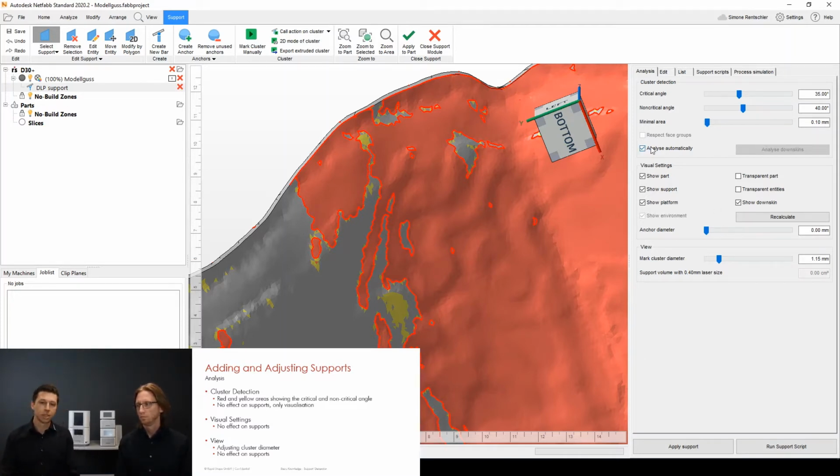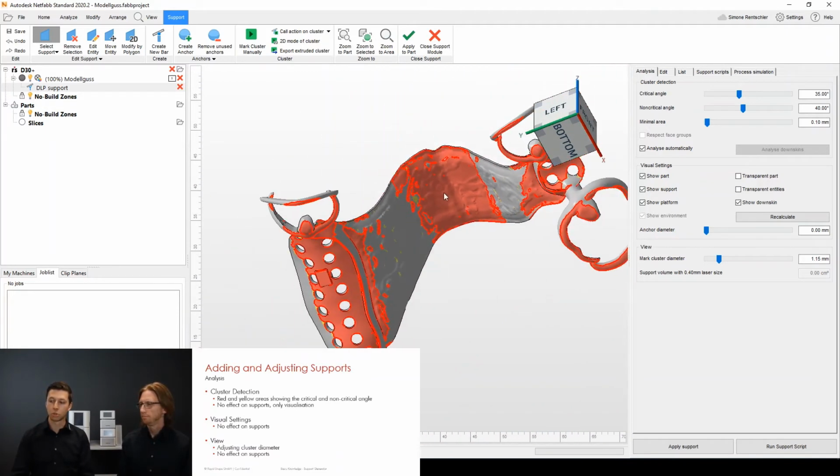You can also set the automatic analyze, or you say, no, I don't want to automatically analyze it because I change the settings first and then I click on the button analyze downskins. So it's up to you. As I mentioned, there's no effect on the supports with this setting. Yeah, that's really important. Same is for the visual settings, the next one. No effects on the supports itself. It's just all about what you prefer to see.